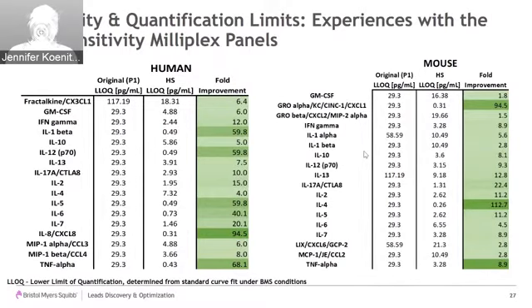Now, the LLOQ is a particular function of how we run our assays and how we run our standard curves. So your individual mileage, depending on how you run your assays, may vary. But in our hands, they have performed very, very well.